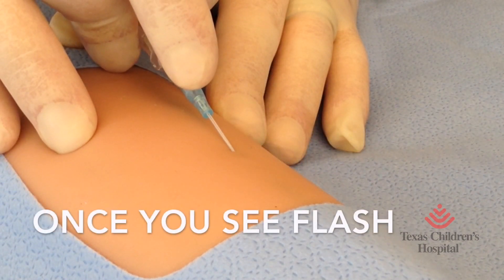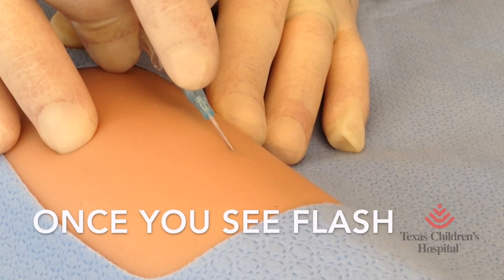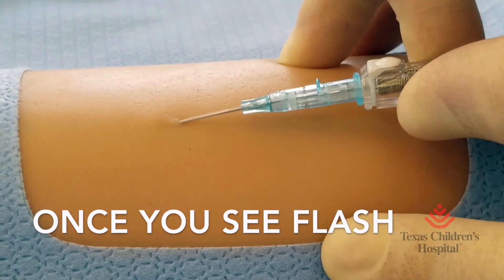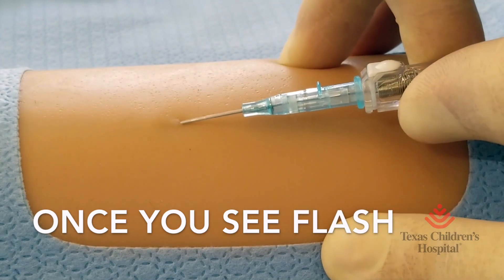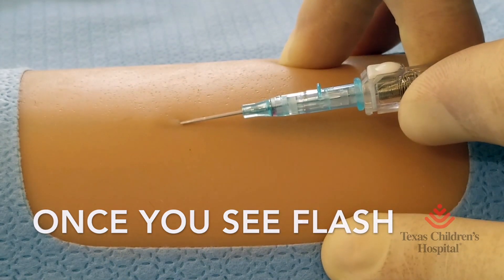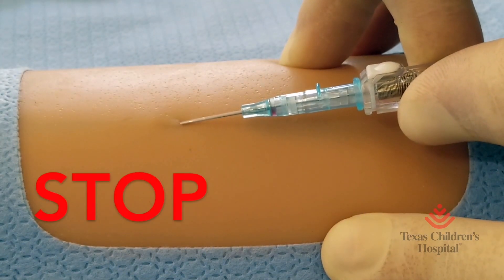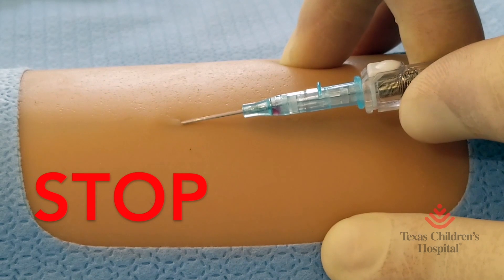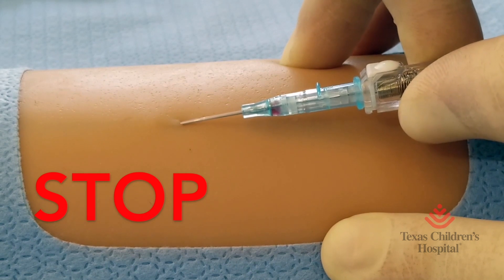Once you enter into the vein, you'll see blood flash. At this time, you'll stop all forward motion. Don't hurry through this part — let blood enter the hub.